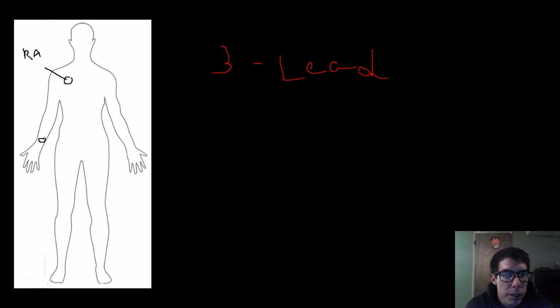or here. And remember, really you could place it anywhere on the arm here, or like the right side of the chest, so like right within that border, and then down the arm. But this area and that area are the 2 most common. They are limb leads, so that means they're supposed to be out on your limbs further.